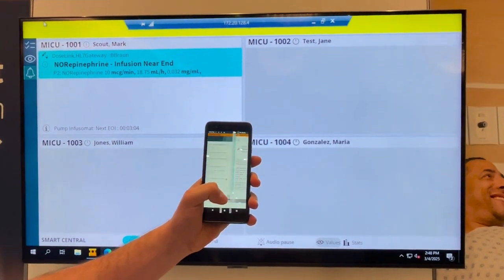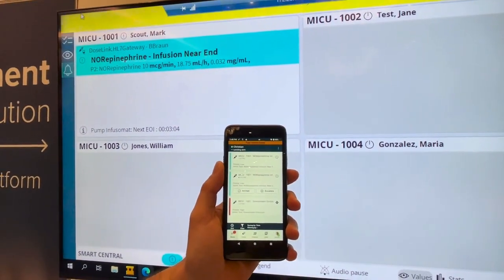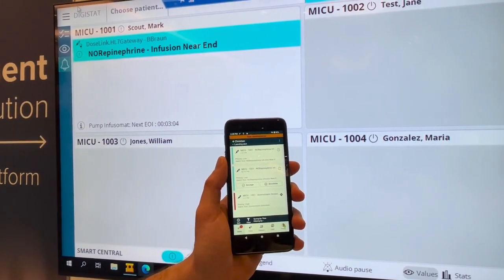You can see how this back association helps solve different issues that we see in real-time associations of these medical devices.